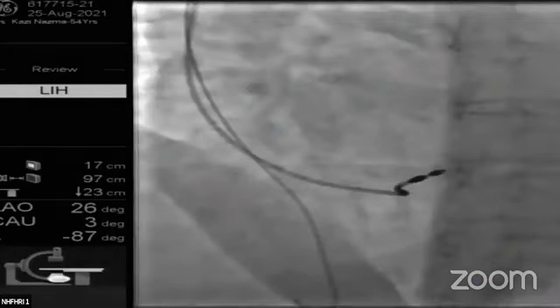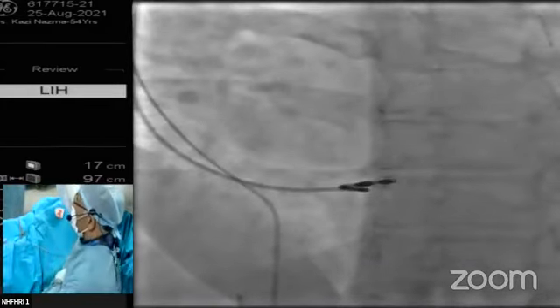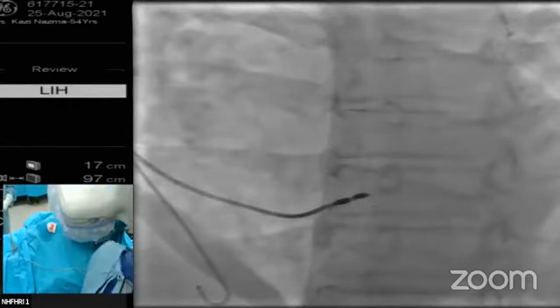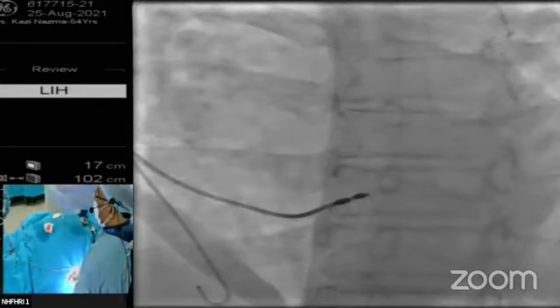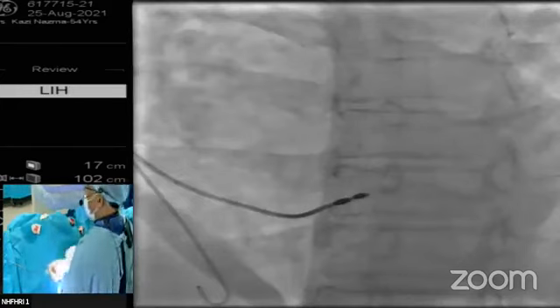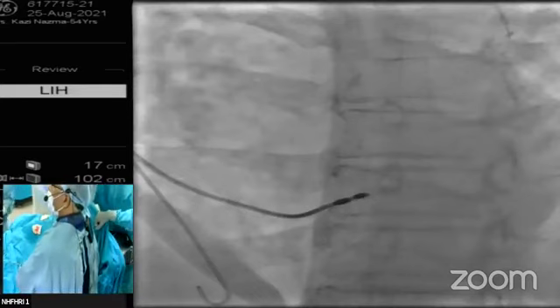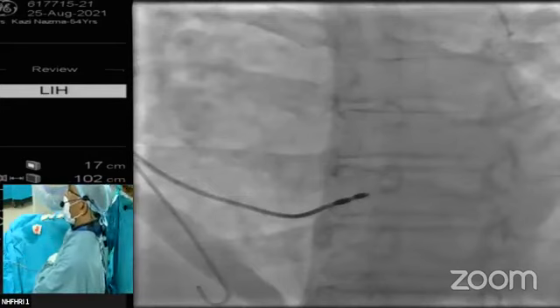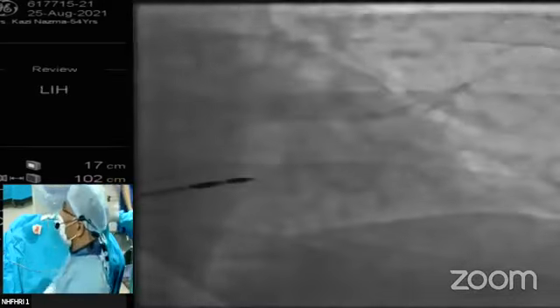So this is towards the spine, this is the septum. Very mid septum, yes. Middle lower septum. Pacing. Yes, so down. What are the advantages of keeping the lead in the septum rather than in the apex? There is an advantage and disadvantage.